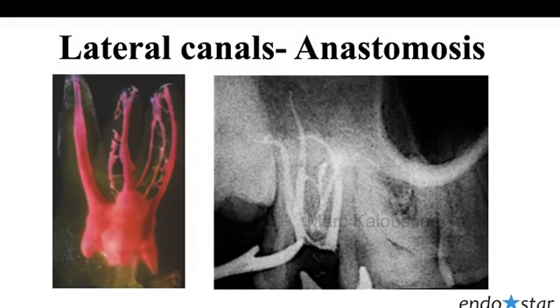But before talking about the instrumentation, we have to keep in mind something very important. The problem when we work on teeth, on patients, when we do root canal, is that we work on the tunnel.